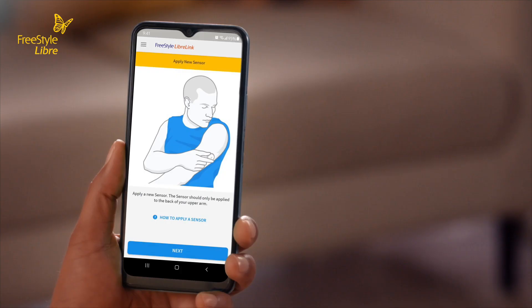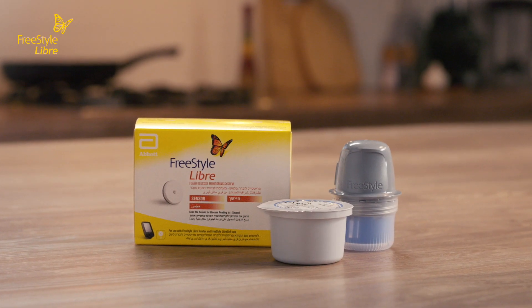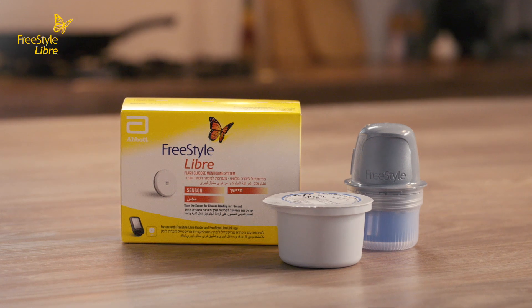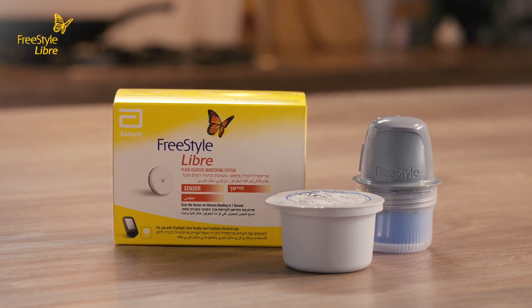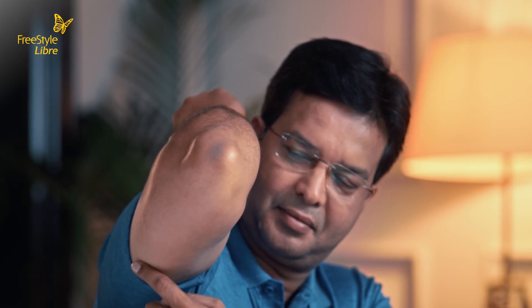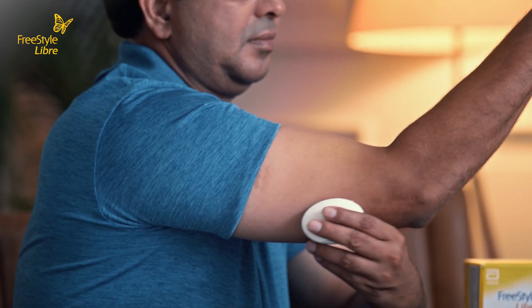Your Freestyle Libre link app is now ready to activate the sensor. Applying the Freestyle Libre sensor is also easy. The Freestyle Libre sensor kit comes in two parts: a sensor applicator and the sensor. To get started, select a site on the back of your upper arm. For optimal application and adhesion of the sensor, ensure the skin is bare and free from body hair. Clean your skin with soap and water, and make sure your skin is completely dry before applying the sensor.